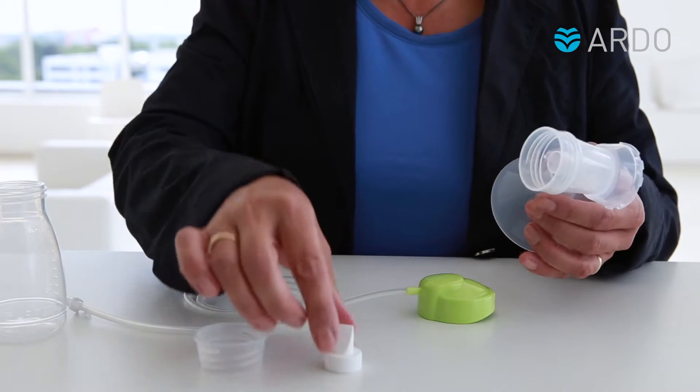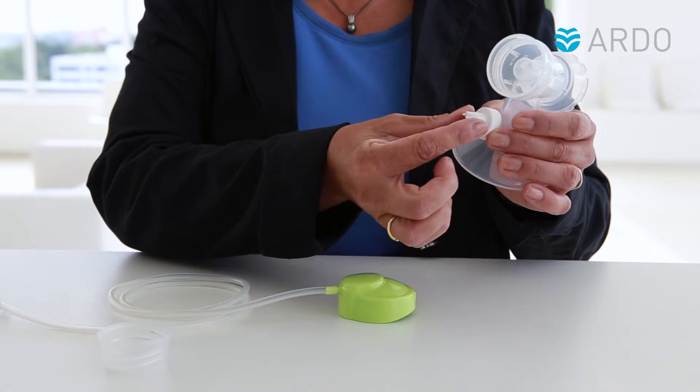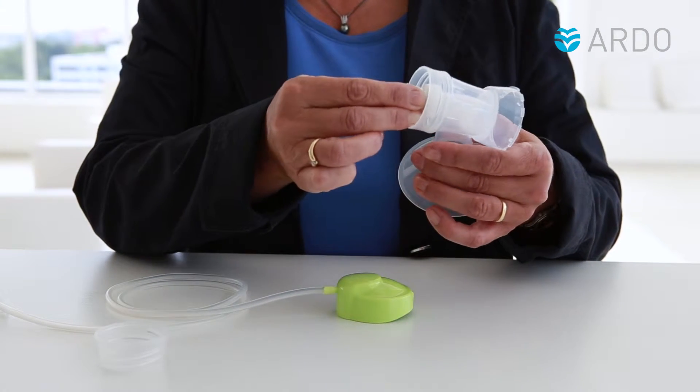Grip the white valve on the reinforced sides and put it into the breast shell. Before assembling, inspect the valve for any tears or milk deposits.